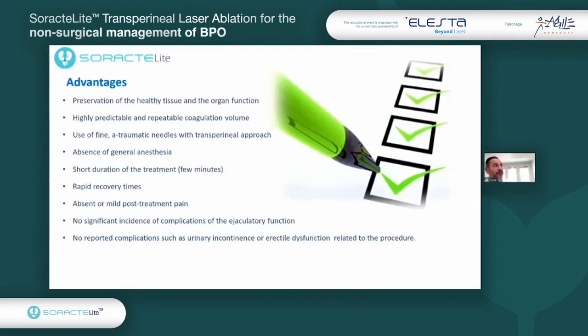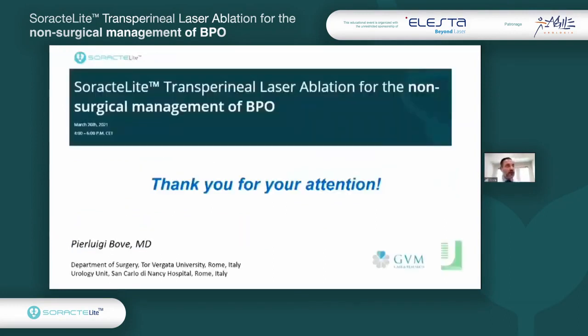There's a very rapid recovery time, with absent or mild post-treatment pain, as I already said. There is no significant incidence of complications of the ejaculatory function, and no reported complications at all such as urinary incontinence or erectile dysfunction related to the procedure. So you will see all this data, I think, in the next presentation, and I thank you for the attention. And also we can move to the next presentation.